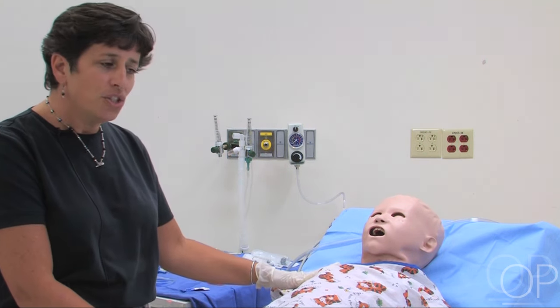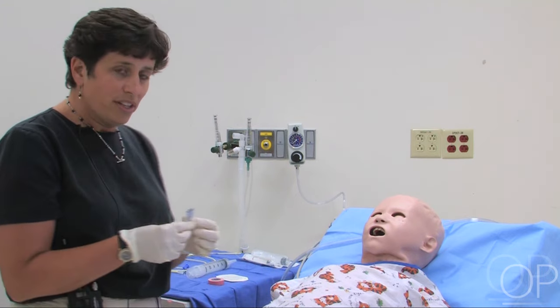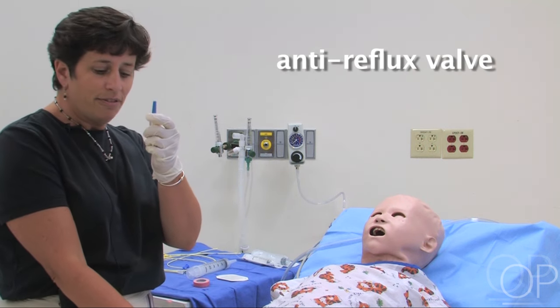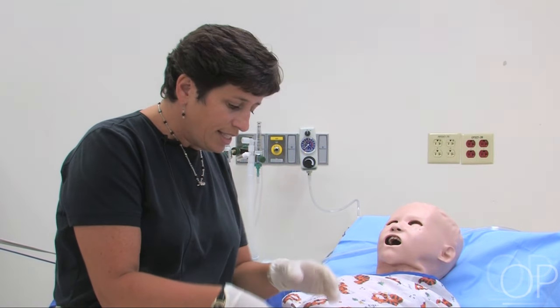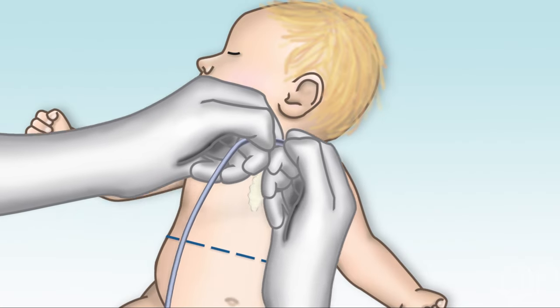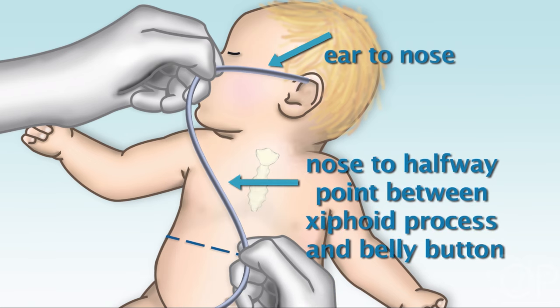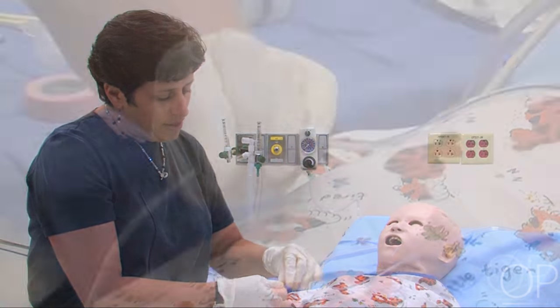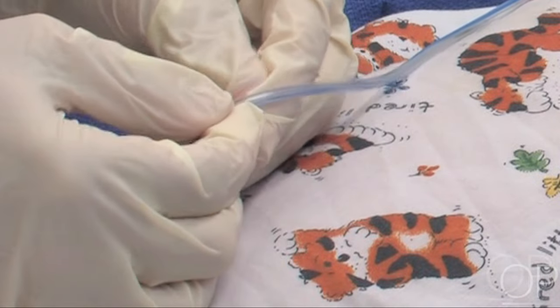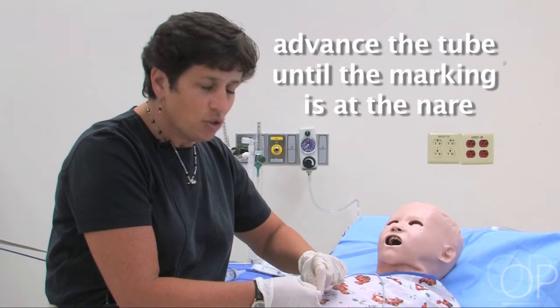I want to make sure he's in a comfortable position and practice swallowing, then pick the appropriate size tube for this patient. I need my lubricant, something to secure the tube with when I'm done, as well as a suction source and my anti-reflux valve. The first thing I want to do is measure. You want to measure from ear to nose, and then from nose to the halfway point between the xiphoid process and the umbilicus or belly button — that should get you to the stomach. Some tubes have markings; if this patient is too small to reach the first marking, take a small piece of tape and mark the tube. That's how far you will advance the tube into the stomach.